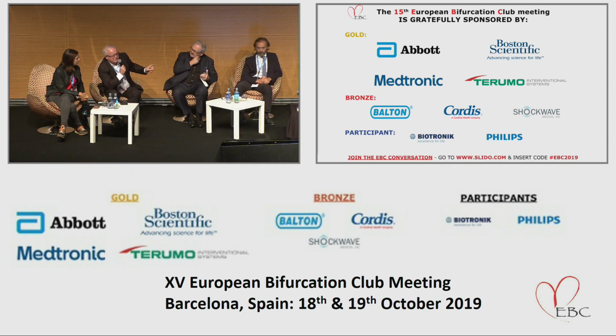So I just want to, Patrick will say better than me. It shows us that when the patient has restenosis, we also have to take into account the treatment which is done and the new restenosis rate. So the first restenosis is not the end of the story of the patient, especially for trials. This is an endpoint, but this is not the end of the story of the patient. You have to take care what will be the result of the second treatment for the restenosis, and maybe the third one and the fourth one.